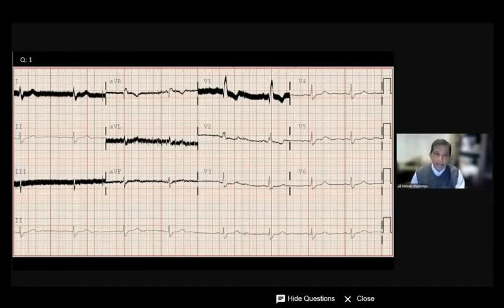Actually, the answer is number one, extrinsic electrical artifact. I posed a question with Parkinson's, and I also put rigors because the patient has fever. Now, let me explain why. The reason is the nature of this artifact. As you see in electrophysiology, we call it a very high frequency artifact. The signal is very thick and very tightly connected, like it's not a muscular artifact as such. The other thing you notice is that it's confined to some electrodes predominantly, like 1, 2, 3, 4.